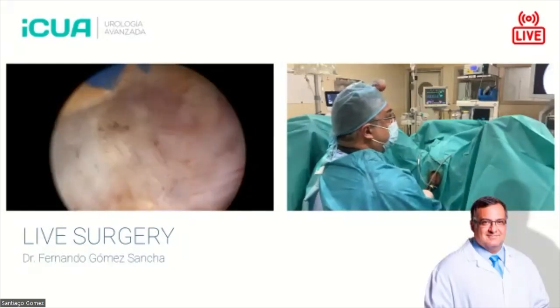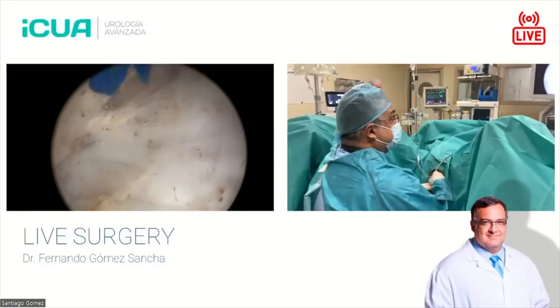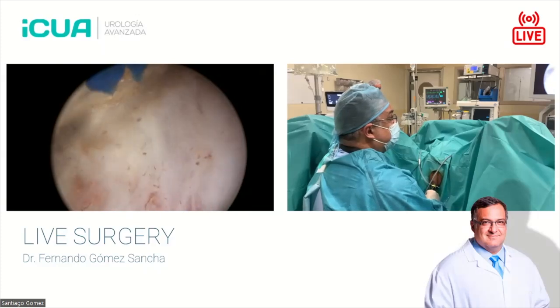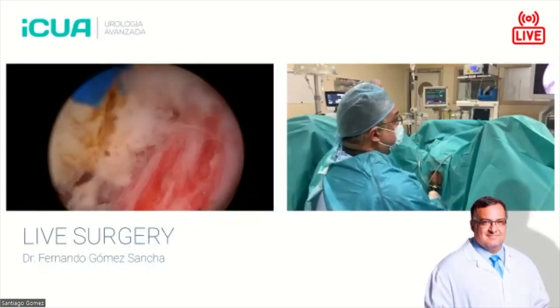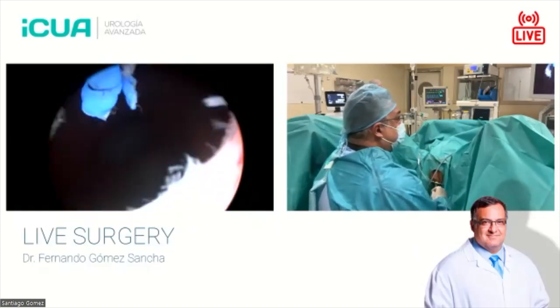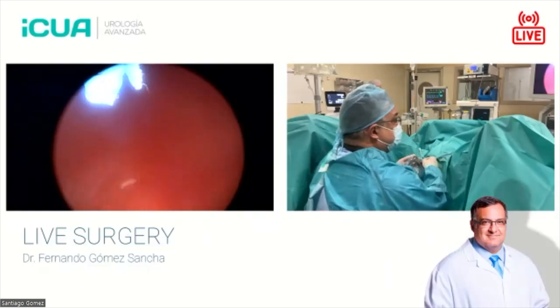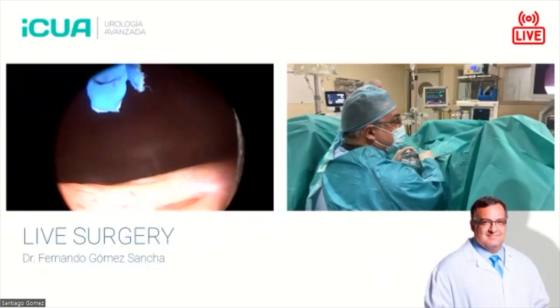So low power, no, thank you. In my opinion. And I tell people, if you start doing HoLEP, of course a low power laser is cheaper, but I would invest the money, because if you do HoLEP, you will have many patients. And if you have many patients, you will need to work in good conditions. You will need to work fast.